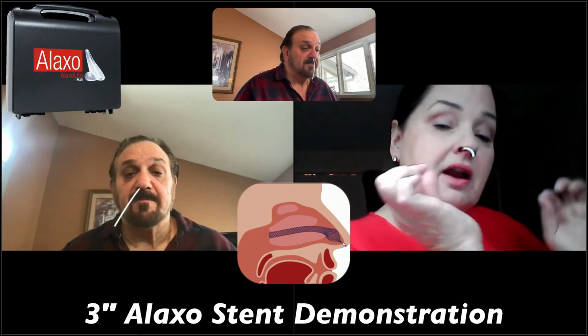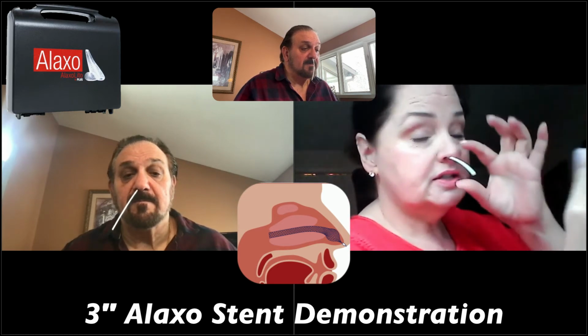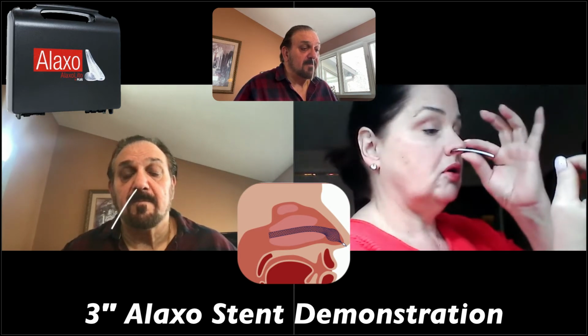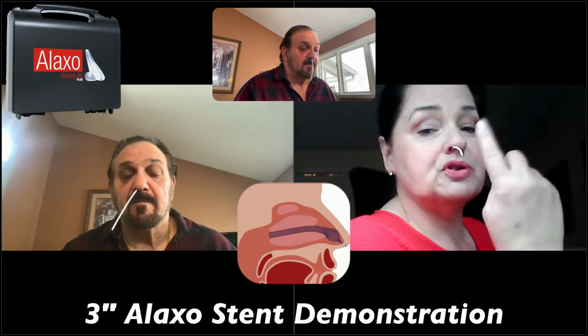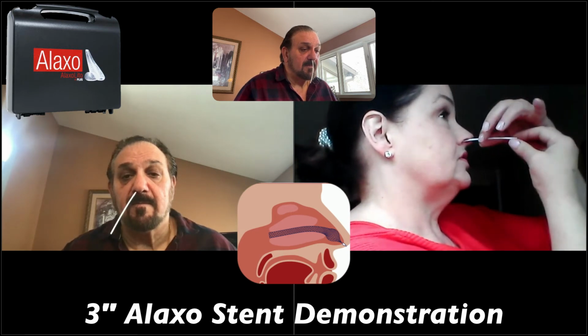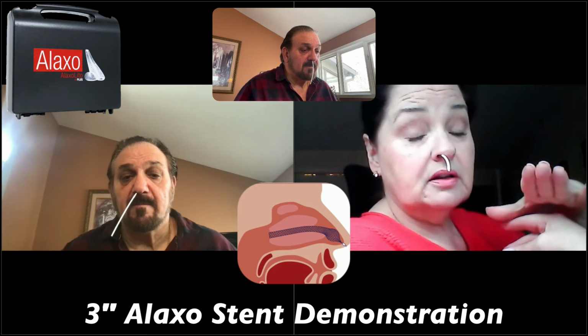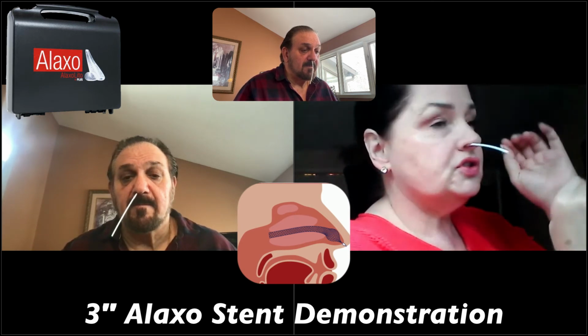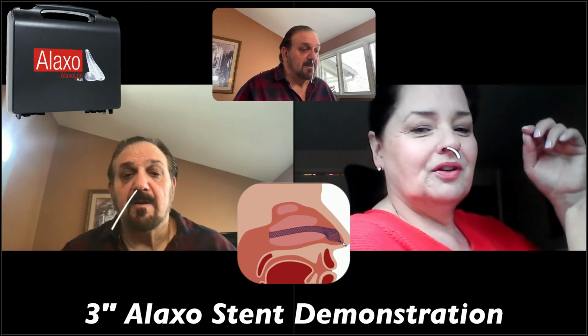Reachable, so now you've got that one tube with the black tip that's covering it and keeping it compressed. So now we're going to retract that back tube all the way down past and off of the introduction tube, of the pusher rod, sorry. I usually do it now in one smooth motion, but if you find it very shocking at first, just take a little bit off and adjust a little bit and then pull it all through.